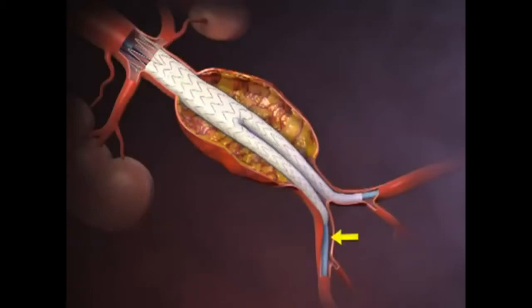The ipsilateral limb of the stent graft is deployed in similar fashion. A balloon is then introduced and used to expand all graft-to-vessel and graft-to-graft junctions in the proximal to distal direction to ensure a tight seal. Finally, the sheaths and guide wires are removed and the femoral artery is repaired.